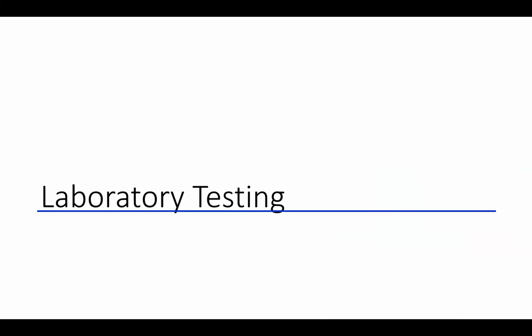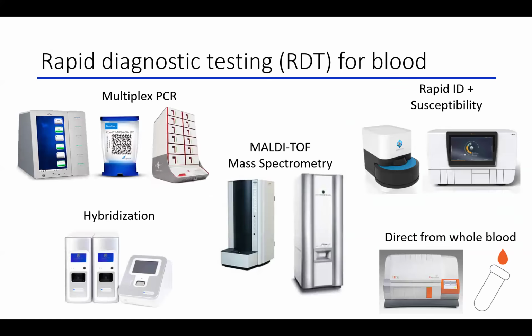Okay. So I'm going to start with laboratory testing, which is more on the diagnostic stewardship side, but I'm going to really highlight antimicrobial stewardship outcomes as well. And the first one, many of you may be familiar with. So this is rapid diagnostic testing for blood culture.